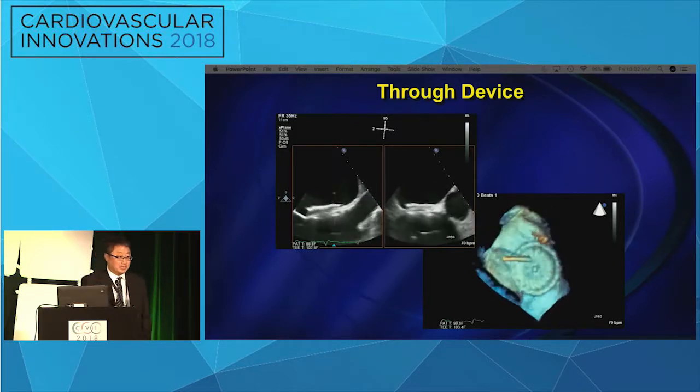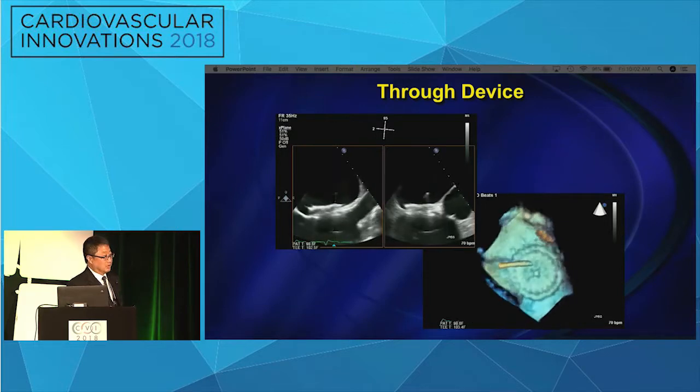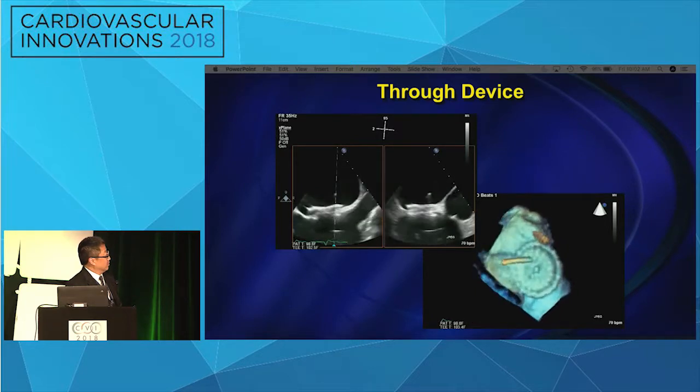I think it gave some warning messages as the needle hit the nitinol, but was able to get through. And here we see it's a reasonable site. We thought that maybe going too close to the periphery, the discs might move and cause some interaction. So it's a little bit closer to the middle.